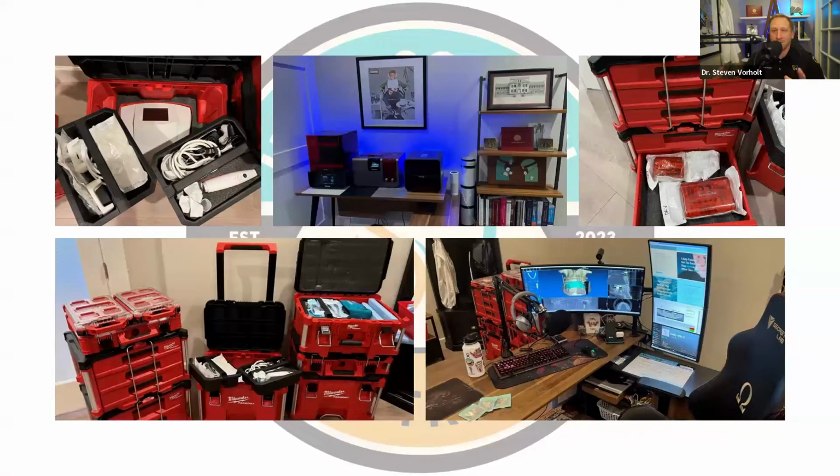So I could plan all of my cases using my Acteon software, even though I clearly didn't have a CBCT at the time because I was working out of my home office. But offices would send me their DICOM file sets, which is just the file set that comes out of a CT when you export it. I could load it into my software, plan the case, diagnose the case, 3D print a surgical guide if necessary, and then pack all this stuff up and go to each office. And so I still occasionally do that when I'm back in the Phoenix area for a select few offices.